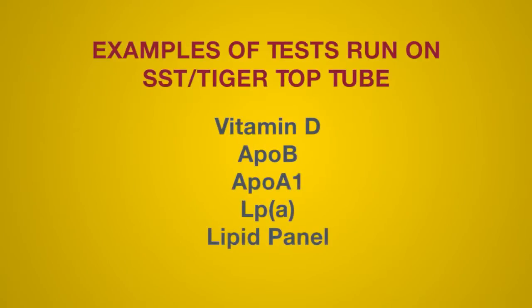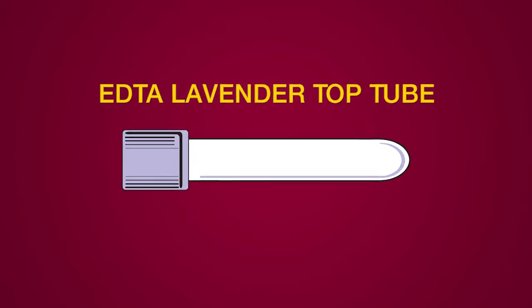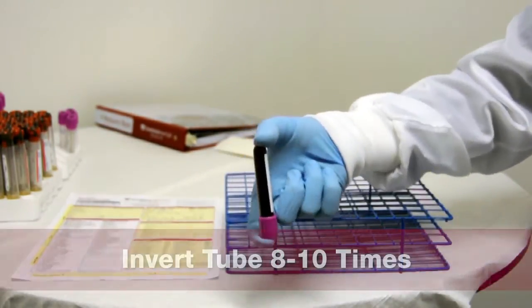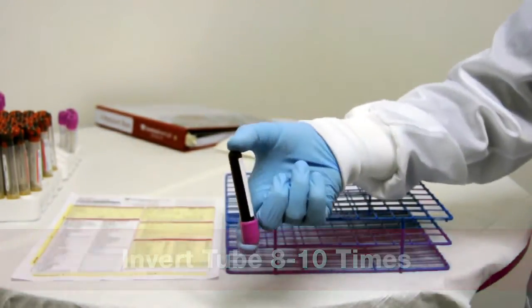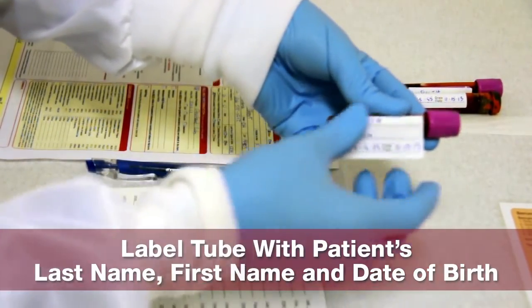Some examples of tests that are run on the SST tube are vitamin D, ApoB, ApoA1, lipoprotein a, and a lipid panel. EDTA lavender top tube. Next, we will discuss the sample handling process for an EDTA lavender top tube. Once a full tube has been drawn, gently invert the tube 8 to 10 times immediately after draw. Then label the tube with the patient's last name, first name, and date of birth.